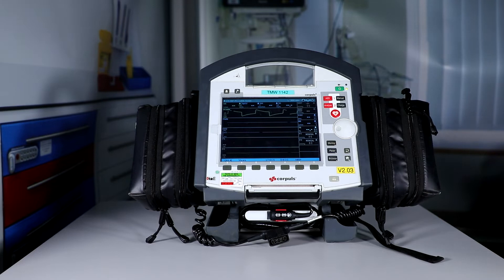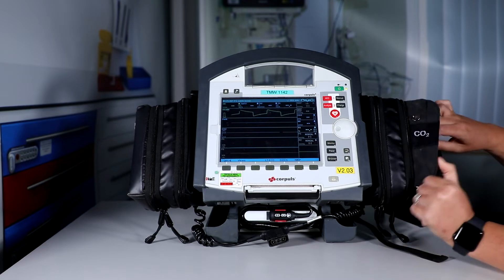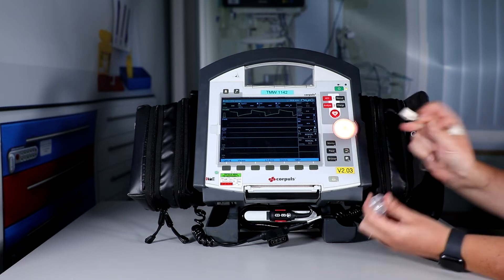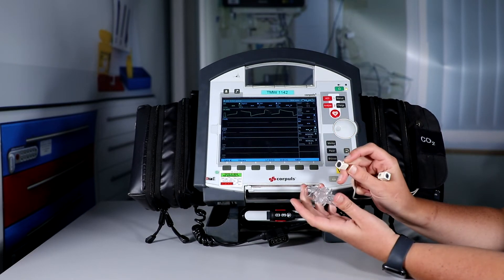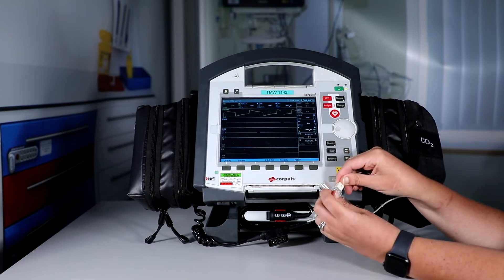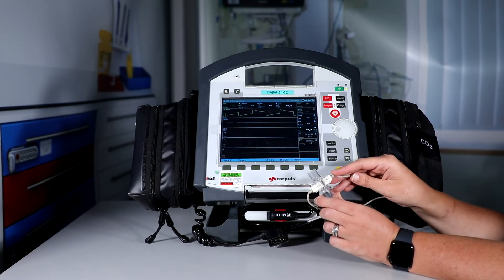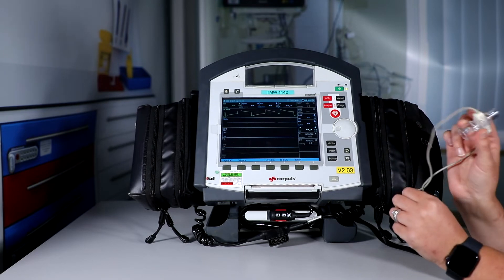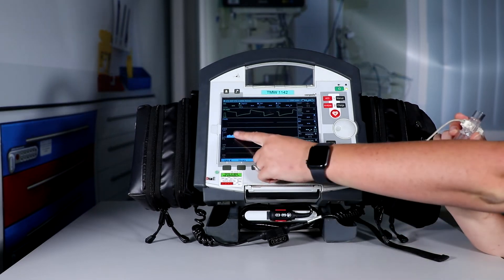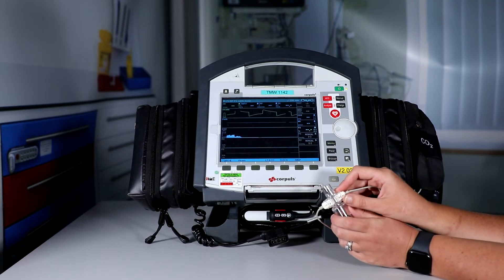Now we're going to check our CO2 sensor. To do this we go into the CO2 pouch and get our testing covet out. We attach these following the small triangles into the covet — they should just click in. What we want to check is that we can see our CO2 curve by blowing into the end of the covet, and as we can see it comes up like so. We also want to check that we've got our parameter and our respiratory rate displayed.